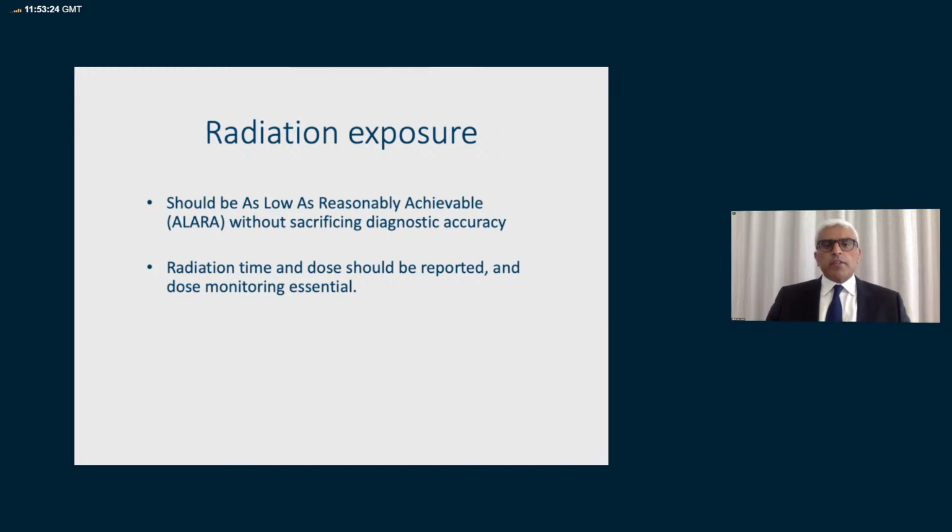The time and the dose of the radiation should be reported, which is for two purposes: A, for audit, and B, if you're doing the test regularly, we can know that over a period of time, we are actually improving our ability to use less radiation and get more information.